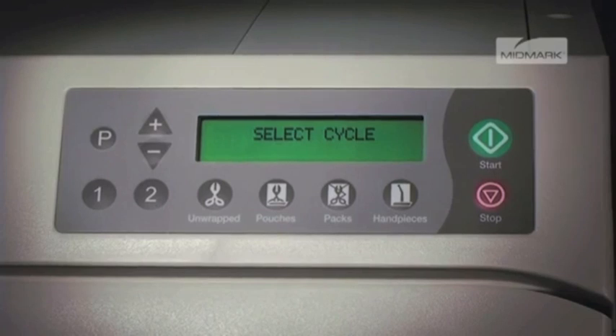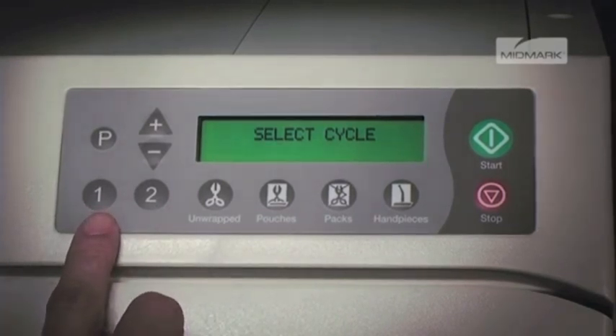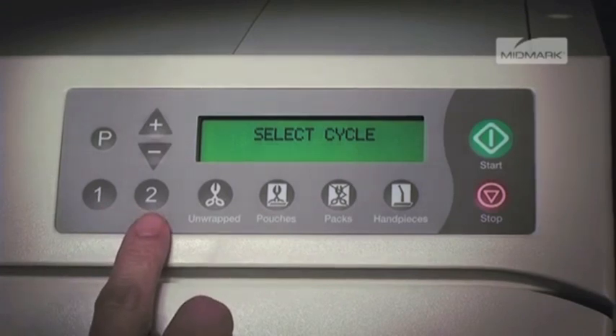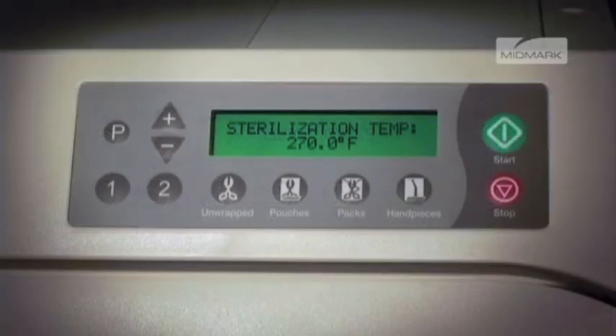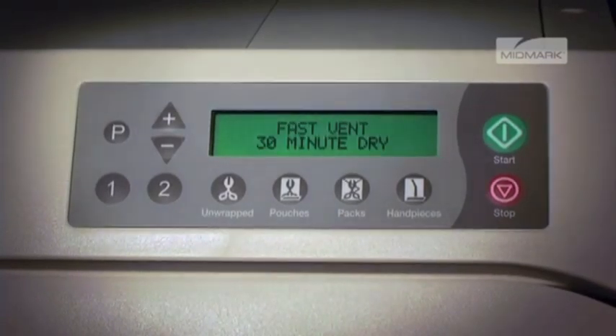To program one of the two programmable cycles, select either the one or two button on the control panel and follow the prompts on the unit display to set the desired sterilizing temperature, sterilizing time, type of vent, and amount of drying time.